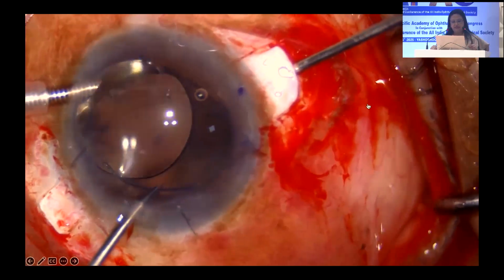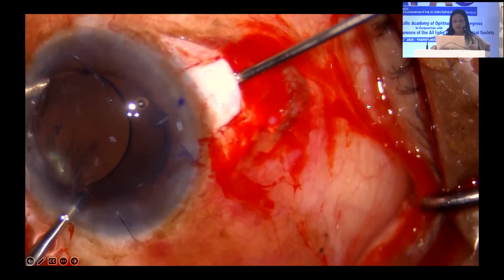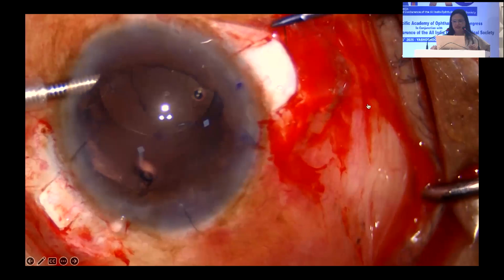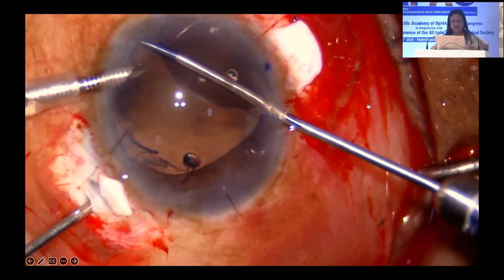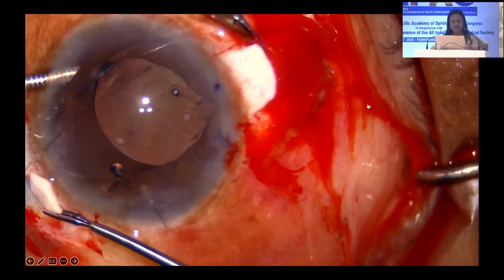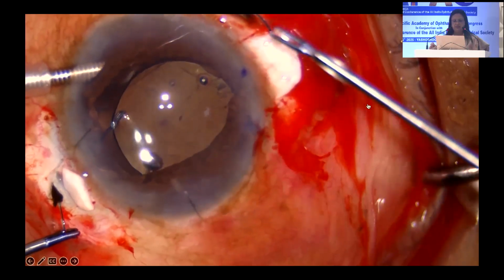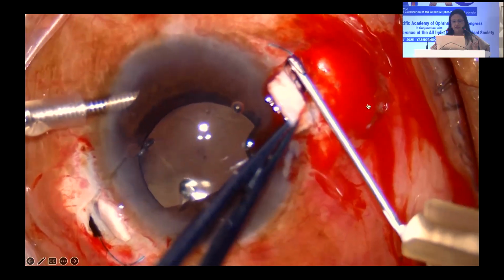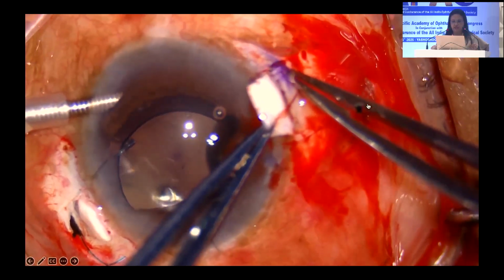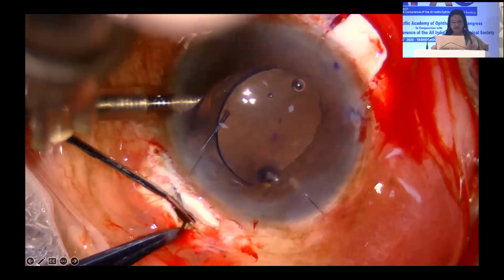You can see that I'm removing the capsular contents, and you can see the handshake technique, where the haptics are being exteriorized using an MST forceps. And again, the other side, it's being exteriorized. In this case, I'm using an AC maintainer. It's very important to either use an AC maintainer or use a posterior infusion. You need to have an infusion on, and now it's tucked into the scleral pockets.